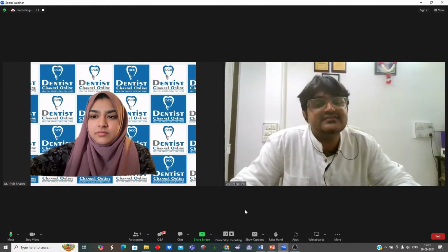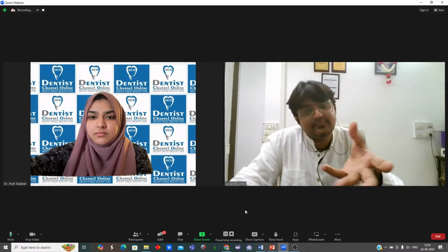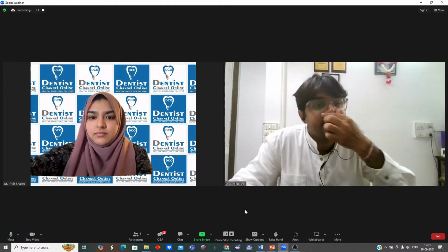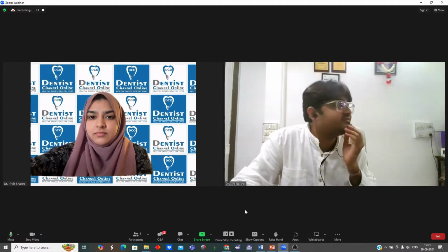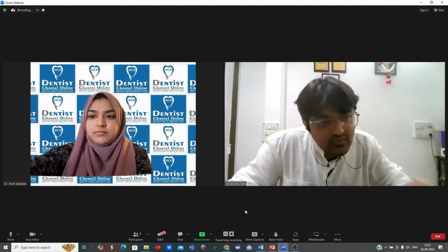But to be honest, you buy the 3D software in which you scan or take a cast of the patient inside the software, then you plan a smile design. It is much better. Nowadays we also have a face scanner, so you can see the front profile as well as the lateral profile, both inside the software. Okay, and then you show it to the patient.